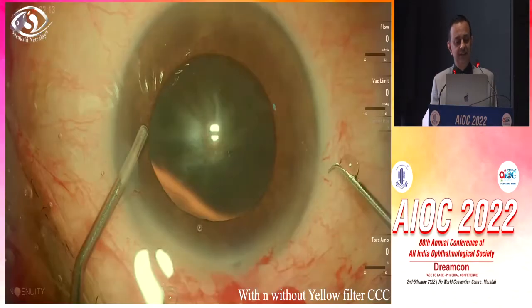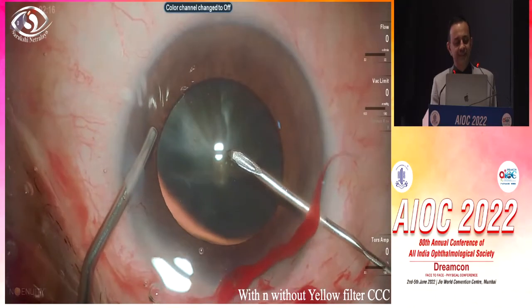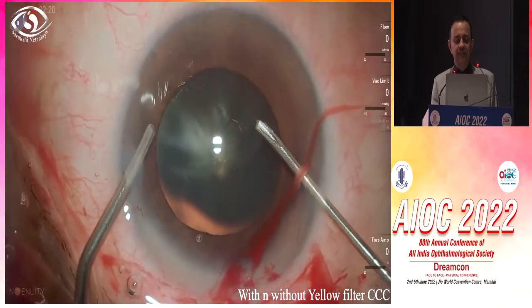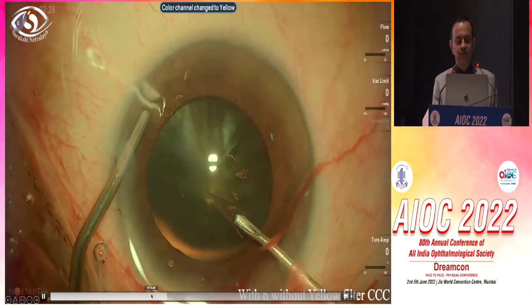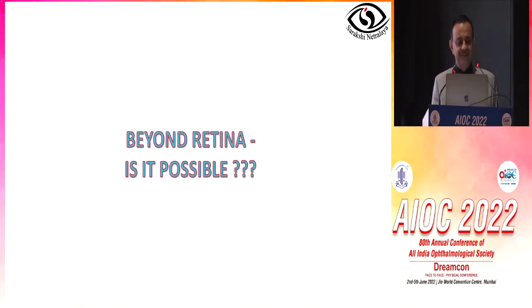Now regarding the color filters, now look at this particular thing. I have stained, but it is not adequately stained. So I'm not able to get the proper view of the capsule in spite of staining. Now what I do is I use a filter over here, and see now suddenly after the use of a filter, the visibility of the capsule has suddenly increased.